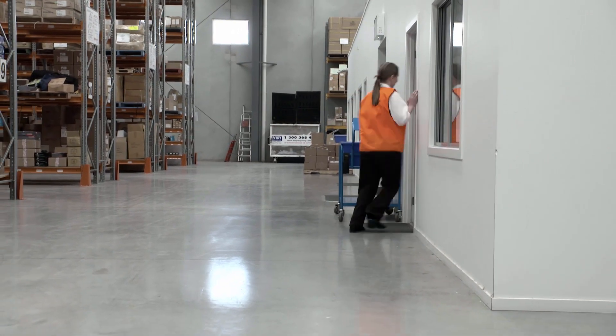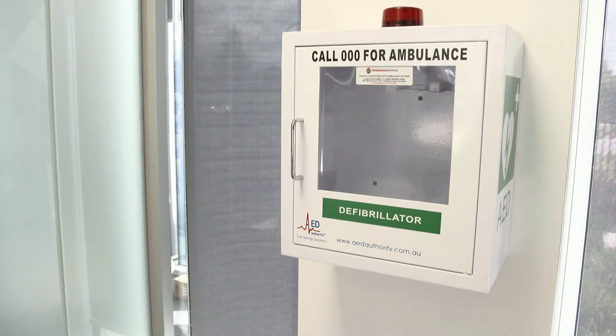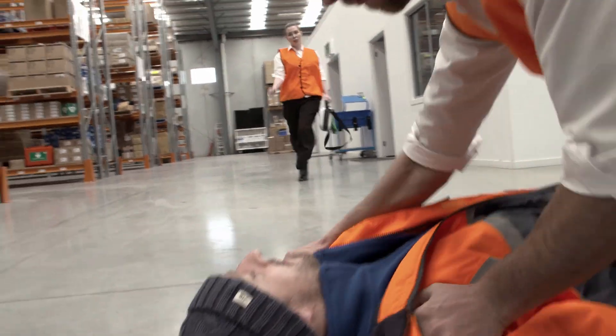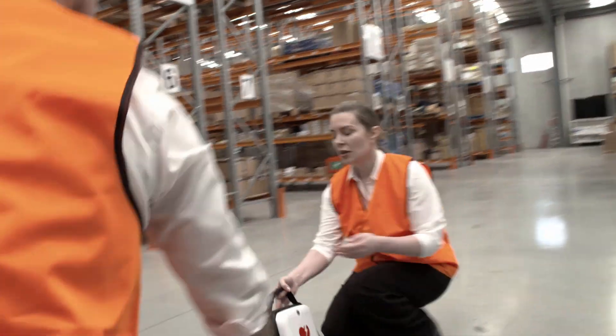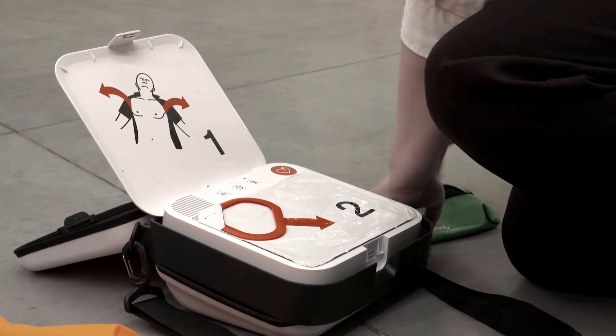The CR2 is one of the easiest defibrillators to operate and will assist and guide you through the rescue. The defibrillator will start automatically when you open the lid, and you can toggle between adult mode or child mode depending on the patient.